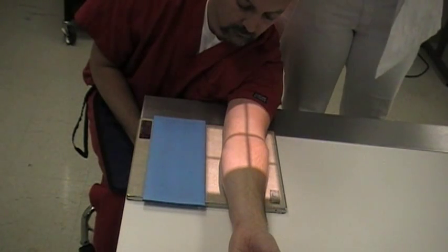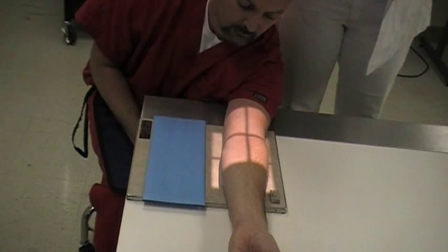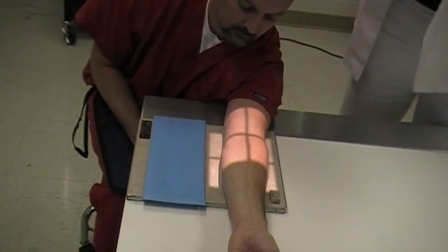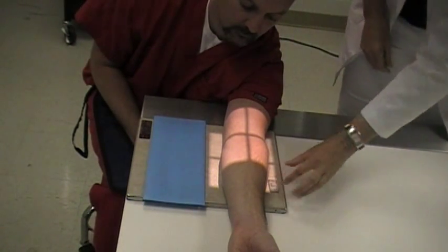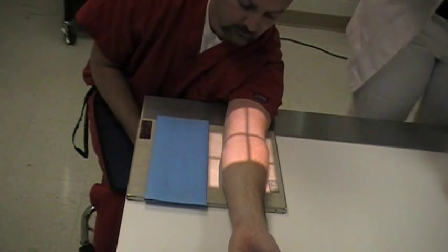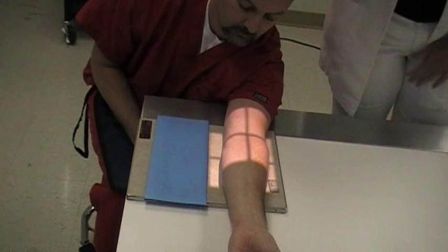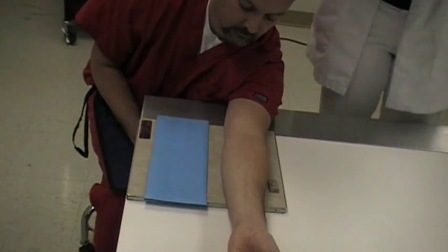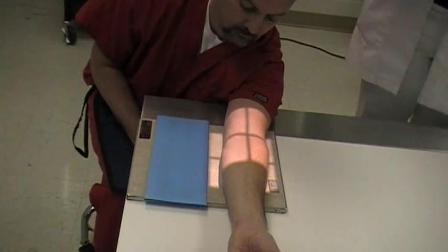And your central ray, you can collimate down to that as well. So make sure and use your marker for the correct elbow. Use the lead shielding to cover the other side of the cassette. So this is our AP elbow.